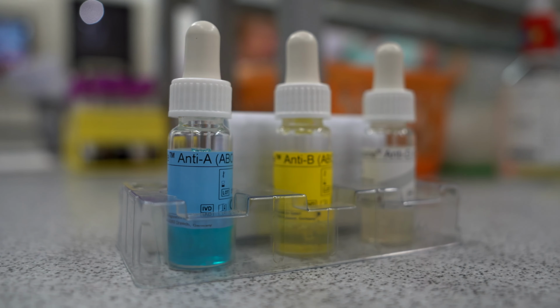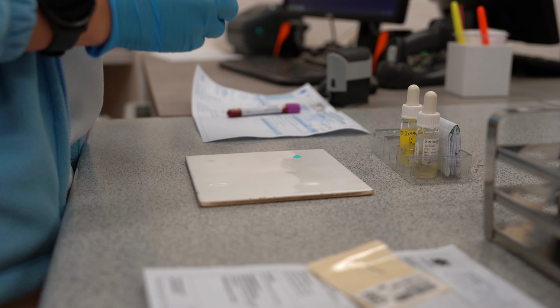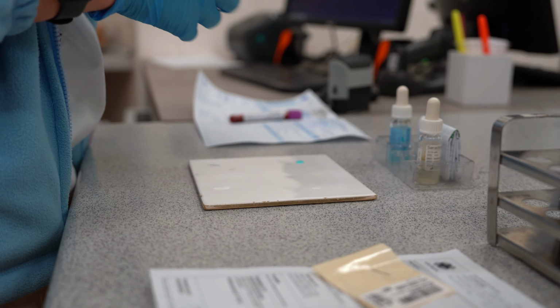If the patient's blood group hasn't been tested in the lab before, a preliminary blood group test is performed using diagnostic sera, anti-A, anti-B, and anti-D.